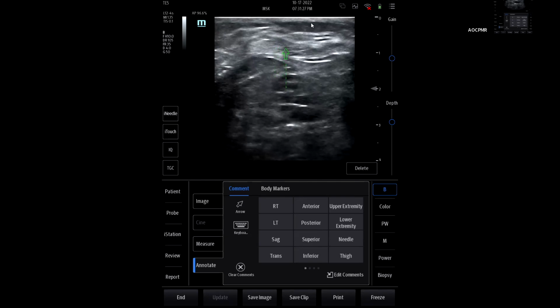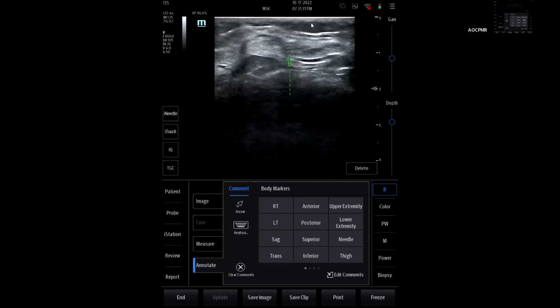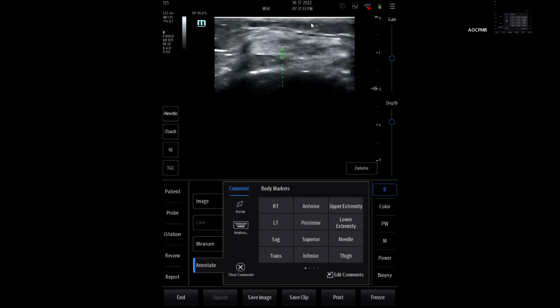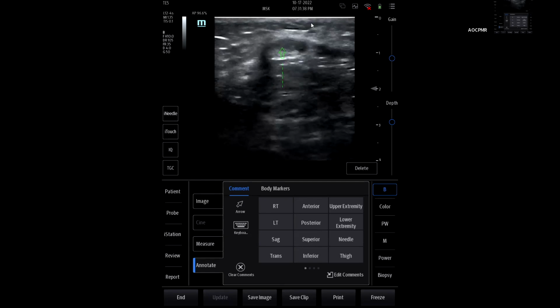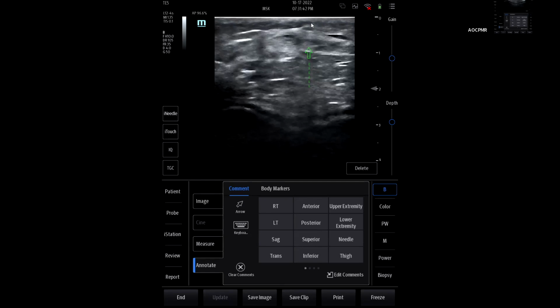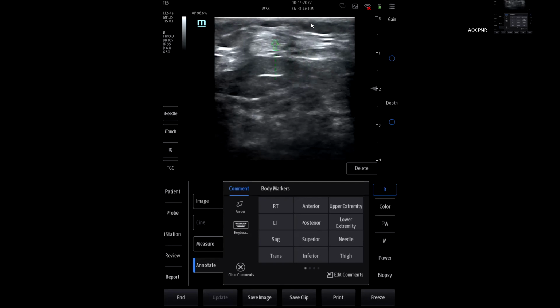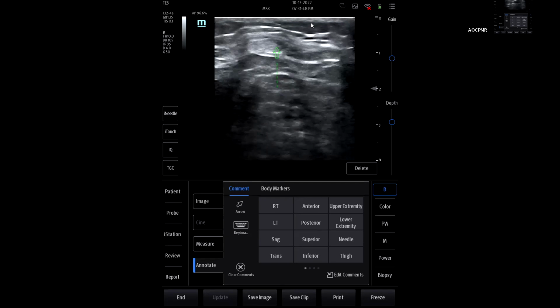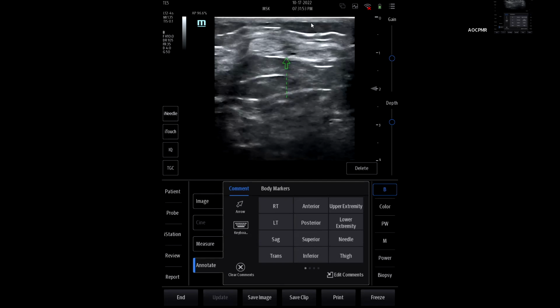Did you have some work done here or no? You did, right? You had ACL repair? Yeah. So you can see a little bit of darkness on this side of the tendon because in Danny over here, she had part of her patellar tendon harvested for ACL reconstruction. So you can see just a little bit on the side. It's not quite as bright as the rest.